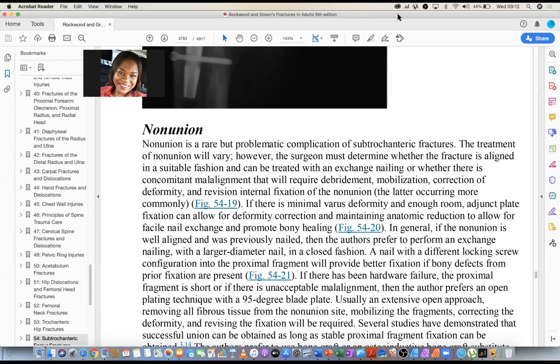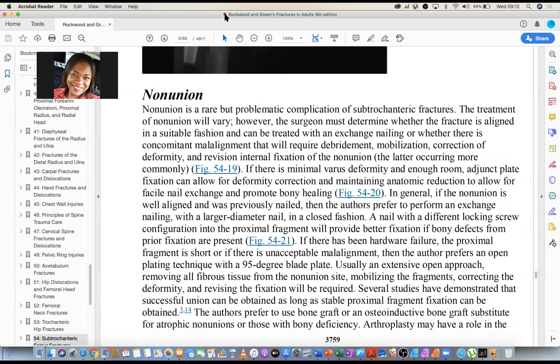Thank you. I had put it down because some of the things I didn't cover. But anyway, I wanted to comment for trainees. Trainees would need to know other types of implant failure, I mean. Because it seems the majority would remember fatigue failure, but there are other forms of implant failure that they would need to learn. You know, ductile failure, plastic failure, to mention some. So they shouldn't focus only on fatigue failure, because there are other ways in which implants fail, and they are expected to know this. Thank you.